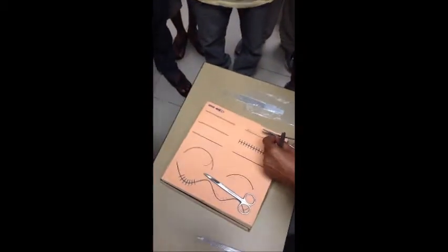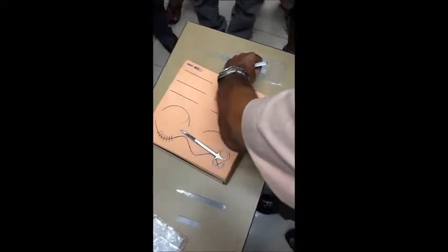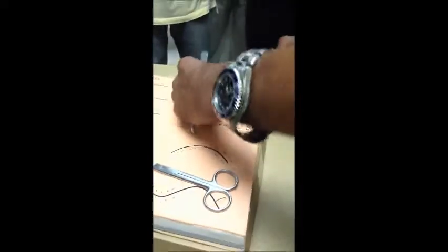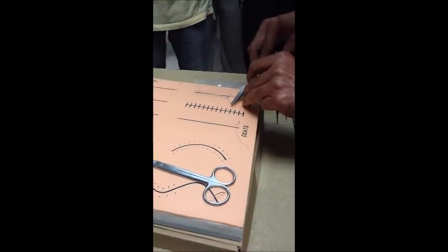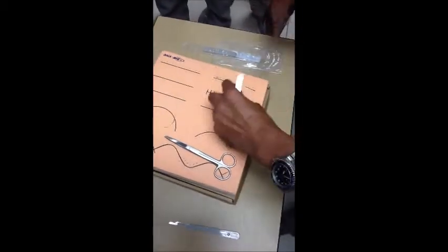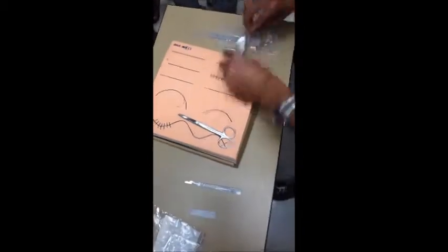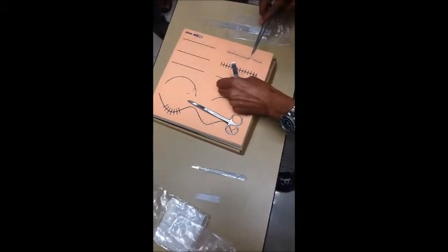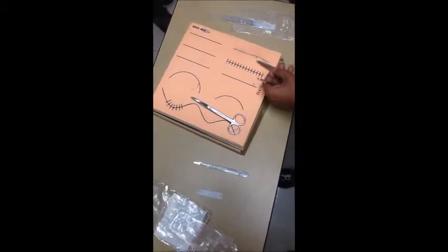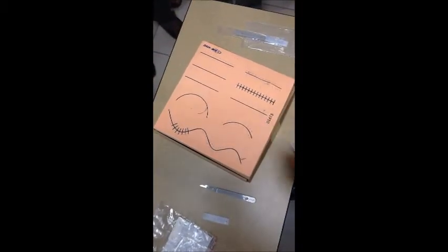A loop here, and I catch hold of this, and I pull, and it becomes a knot. Then again I take the reverse, catch hold of the tip here, and I pull, and it becomes a knot. Then I catch here, put multiple throws, there we go, and we are done. I'm assuming that we have reached the end of our linea alba and we cut it off.